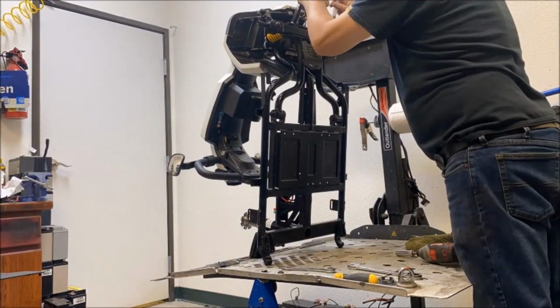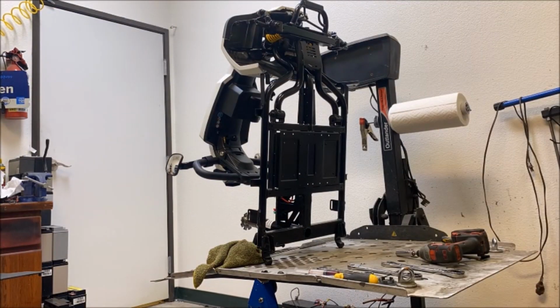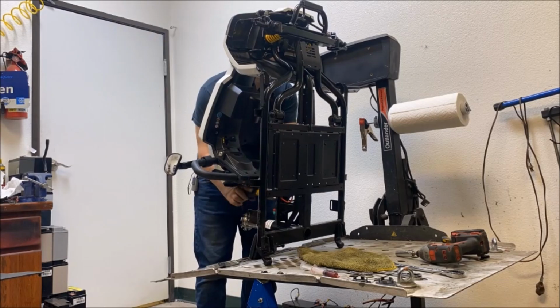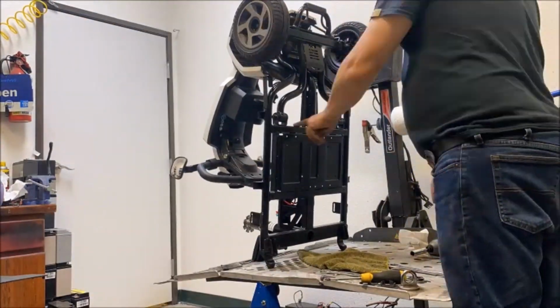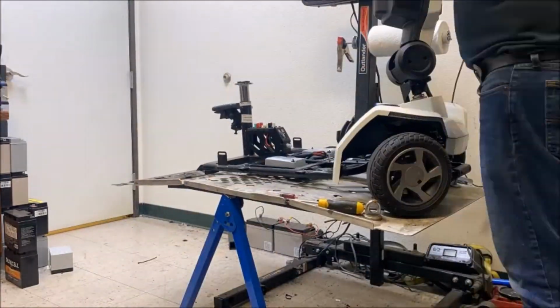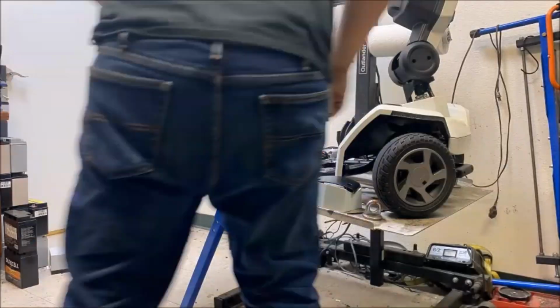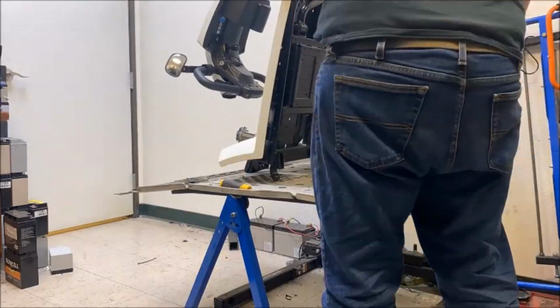Inspect the bearings, feel them, make sure they're running nice and free, not gritty or damaged. Hair does cause a lot of damage in front wheel bearings because they're grease-filled bearings, you can tell by the black ring, and the hair will pull the grease out of the bearings, and they'll end up getting gritty, or if not, break apart. I've seen quite a few wheels where they've broken apart. And replacing wheel bearings, well, if you can find the bearings, then change the bearings out. There's usually one on both sides, one on the front, one on the back.